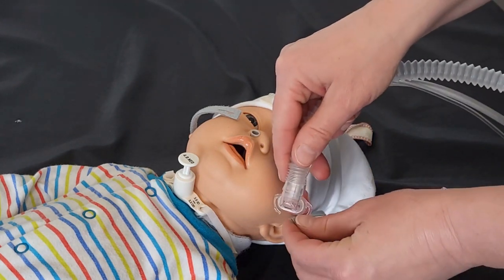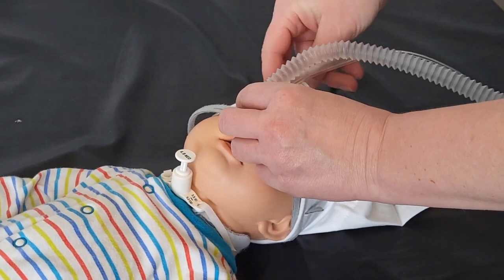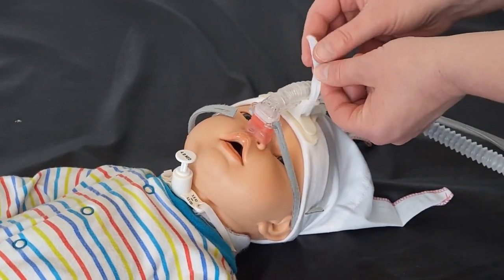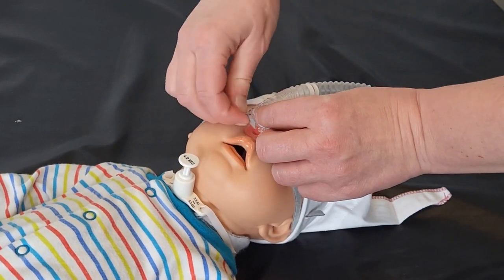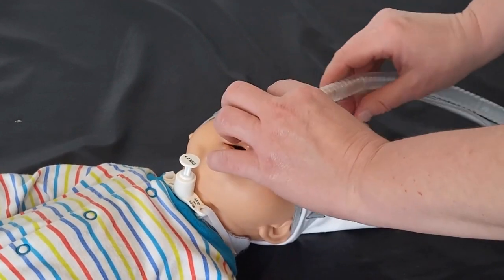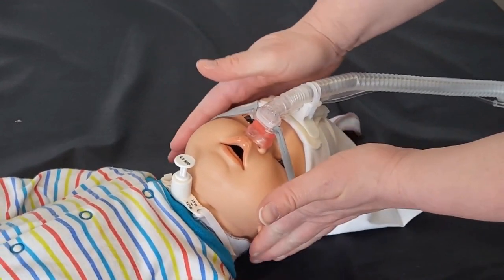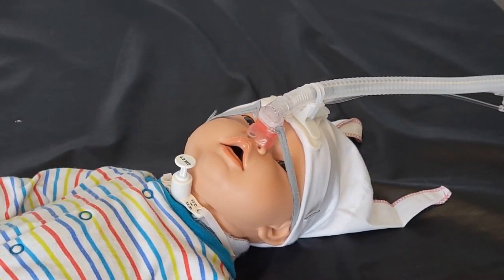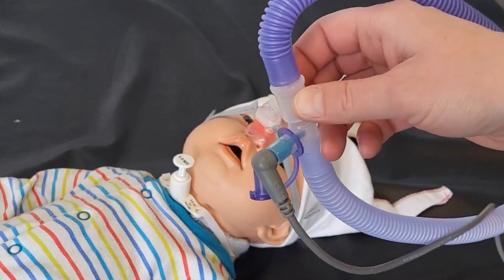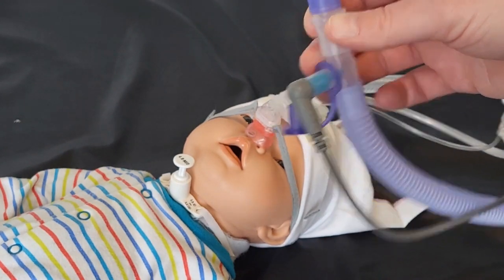Begin by first attaching one strap, placing the mask over the baby, securing the tubing into the T-piece, and then bringing the other strap up and attaching it onto the hook. At this point you can reposition for comfort, get a good seal, and adjust the straps to make them tighter or looser. All tubing should be up off the top end of the bed or coming out of the incubator. Make sure the blue temperature probe is not inside the incubator or under any kind of heat lamps or ultraviolet lights.